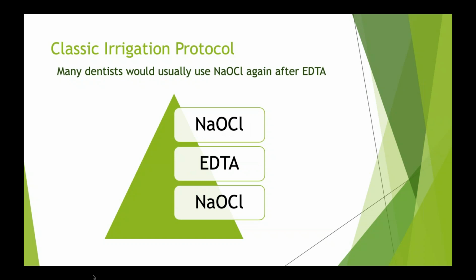teeth. Now if I have a tooth, what I do is I go in and I introduce my bleach throughout the entire time I'm cleaning and shaping. At the very end of the process I add my EDTA. Well, the problem is most clinicians want to go, okay, well I need to rinse my EDTA out, so I'm going to go right back in with bleach and I'm going to rinse it back out.